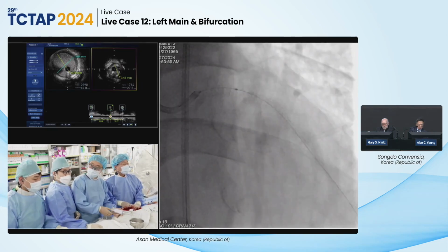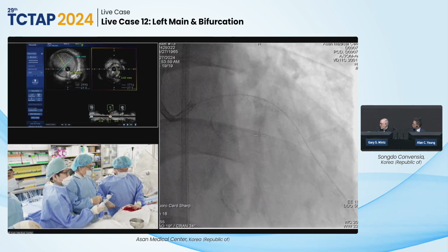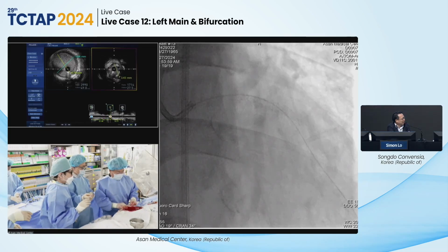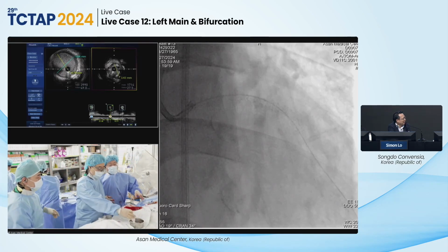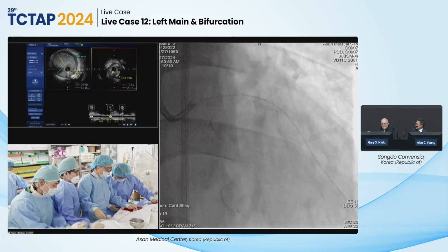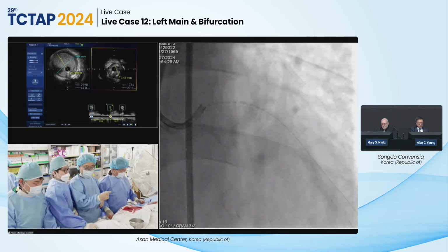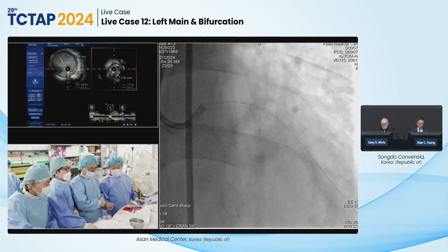24 size is 3.7. The common teaching was that when you do a left main stem, you put 2 wires in and make sure that there is 1 wire in the circumflex. Nowadays, one can be daring enough to forget about the circumflex. Usually we put a wire in the circumflex and IVUS it, and if it looks really wide open, then it probably doesn't matter. Yes, that is a critical point. If the angle is narrow and there is some significant disease, we usually put the wire in the side branch.